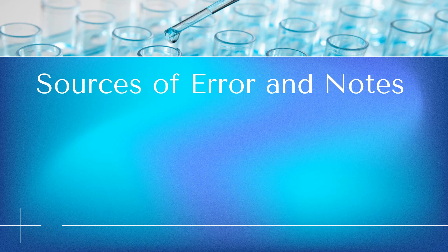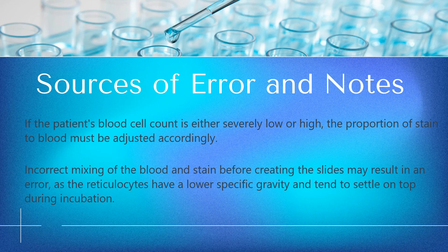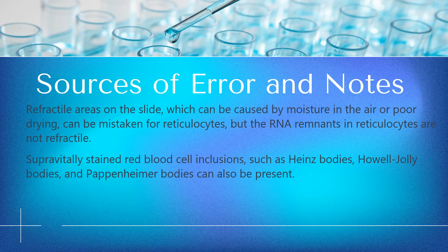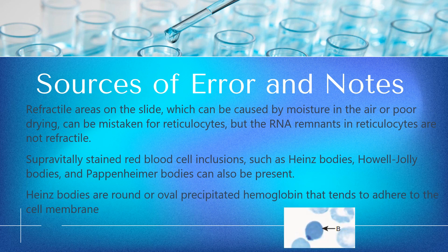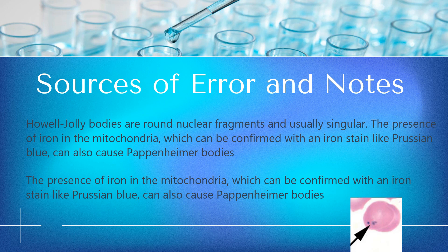Sources of Error: If the patient's blood cell count is severely low or high, the proportion of stain to blood must be adjusted. Incorrect mixing before creating slides may cause error, as reticulocytes have lower specific gravity and tend to settle on top during incubation. Refractile areas on the slide, caused by moisture or poor drying, can be mistaken for reticulocytes, but RNA remnants in reticulocytes are not refractile. Supravitally stained red blood cell inclusions such as Heinz bodies, Howell-Jolly bodies, and Pappenheimer bodies can also be present. Heinz bodies are round or oval precipitated hemoglobin adhering to the cell membrane, while Howell-Jolly bodies are round nuclear fragments. Iron in mitochondria, confirmed with Prussian blue iron stain, can also cause Pappenheimer bodies.